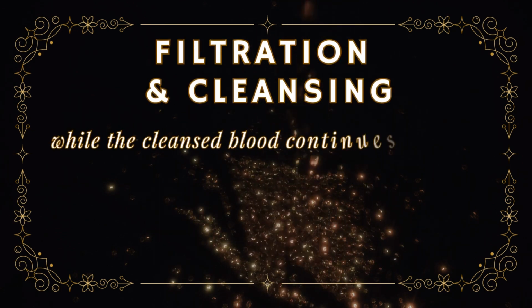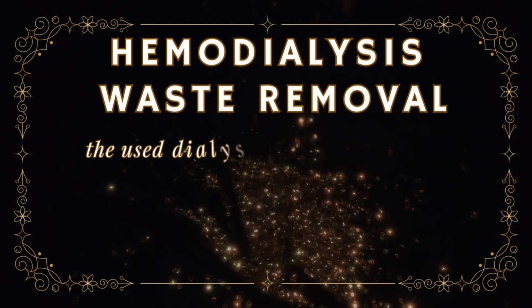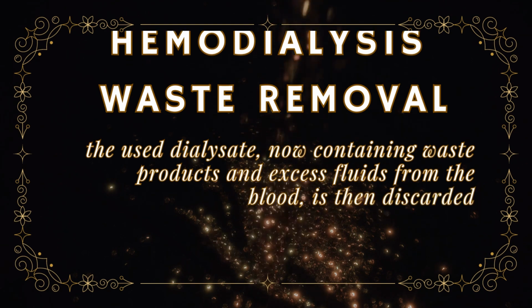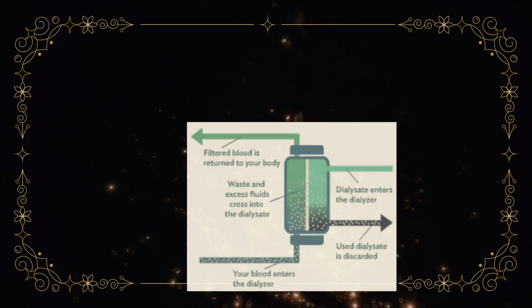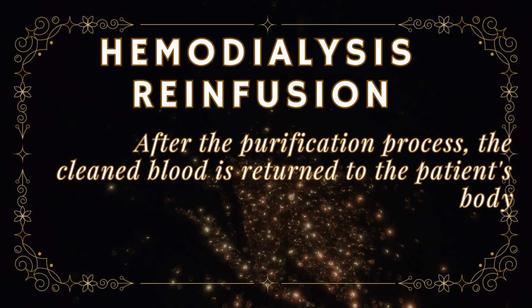While the cleansed blood continues to circulate through the dialyzer, the used dialysate, now containing waste products and excess fluids from the blood, is then discarded. After the purification process, the clean blood is returned to the patient's body.